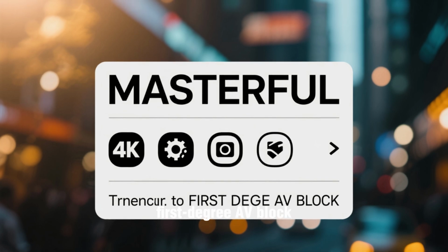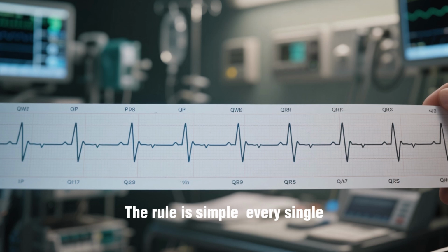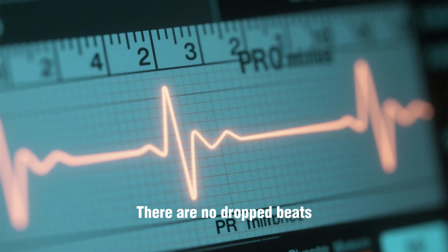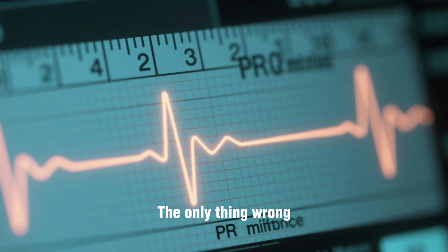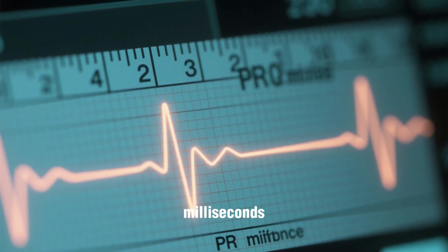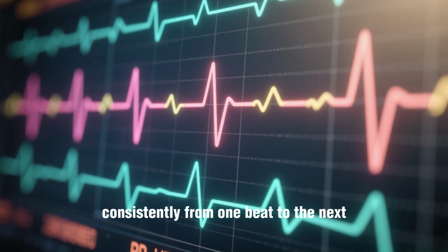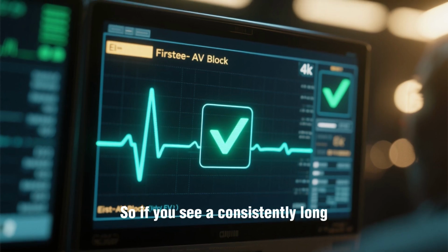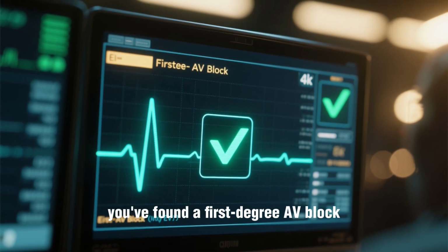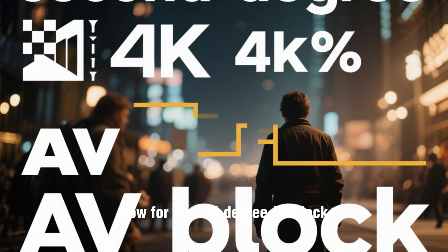Alright, let's start with the easiest one. First-degree AV block. This one is super straightforward. The rule is simple. Every single P wave is followed by a QRS complex. No dropped beats. The only thing wrong is that the PR interval is prolonged, meaning it's greater than 200 milliseconds. And it stays that way consistently from one beat to the next. So, if you see a consistently long PR interval with a 1:1 P to QRS ratio, you've found a first-degree AV block. That's it.